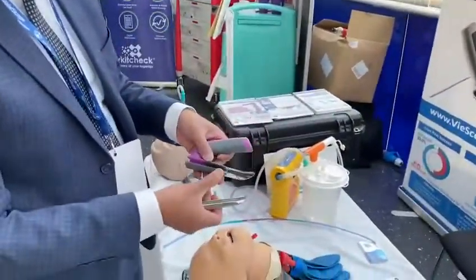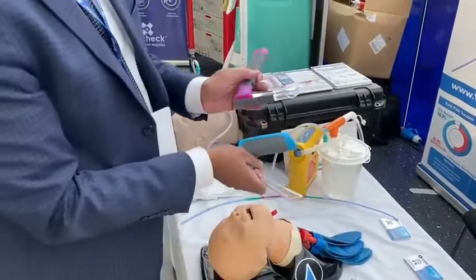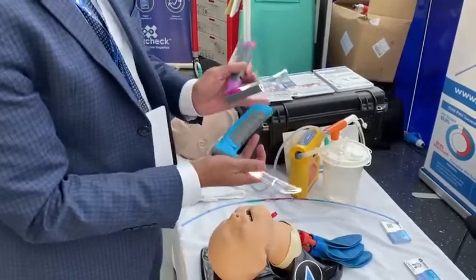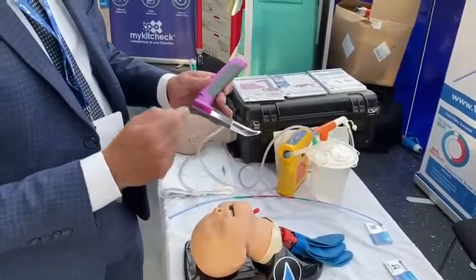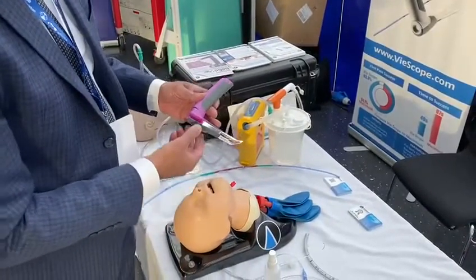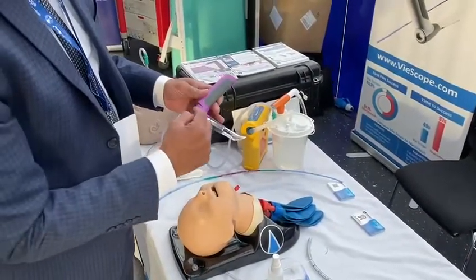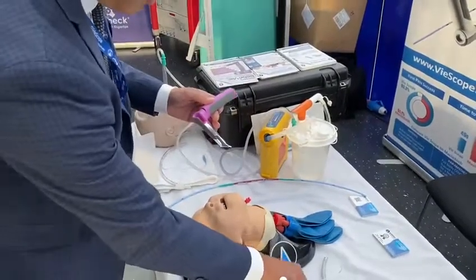We've made a disposable device with the same patented light source from the proximal to the distal end, but it's got an open channel on the right side so we can pass an endotracheal tube directly into it. Children change in size very quickly, so having an open channel to pass the tube directly is a design that we came up with.